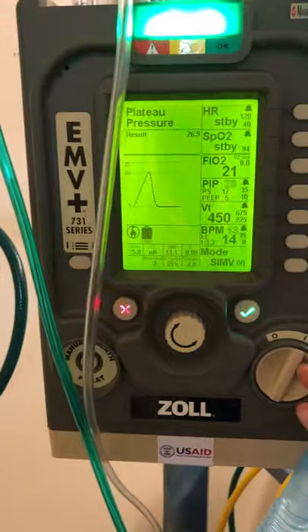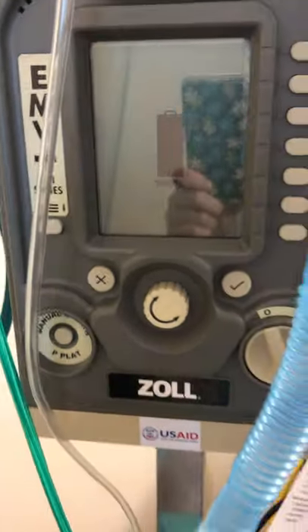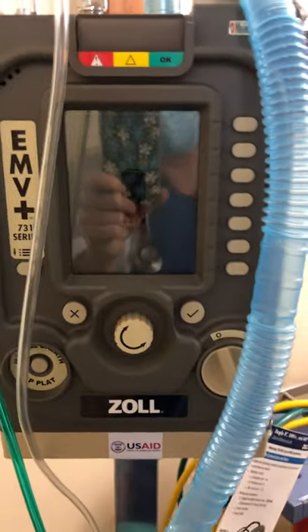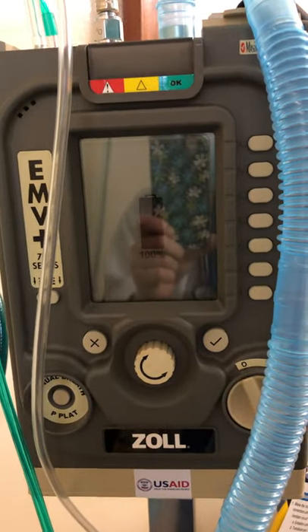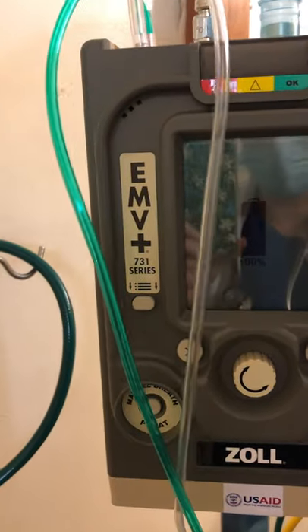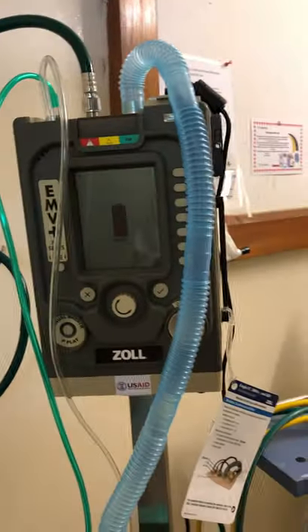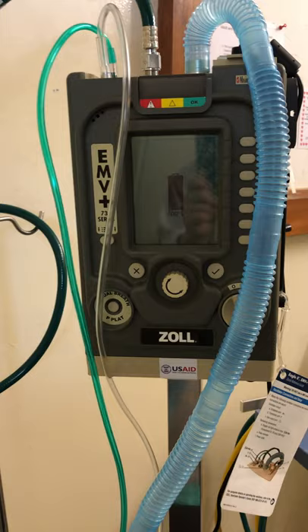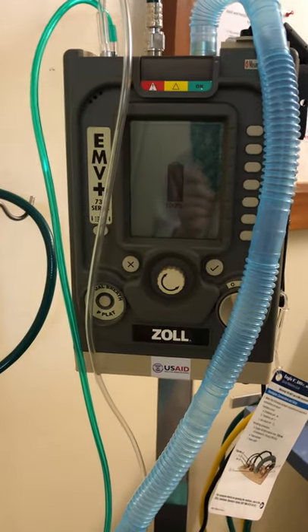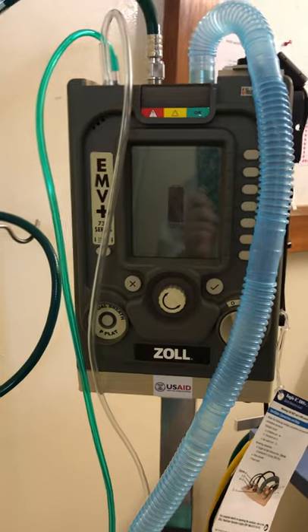When you're done using the machine, you just switch it off. Be aware this machine is really easy to turn off — it does not alarm. So just be aware that when you're turning it off, it is off. There's no standby mode. These circuits we are still looking to source in country. Ideally they're single patient use. As always, make sure you ask questions if you have questions. Thank you.